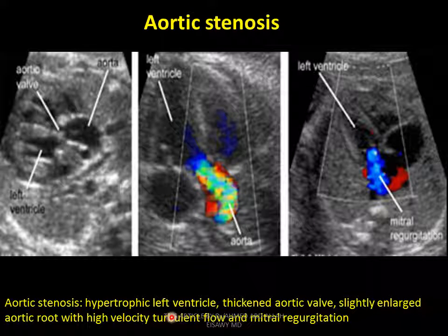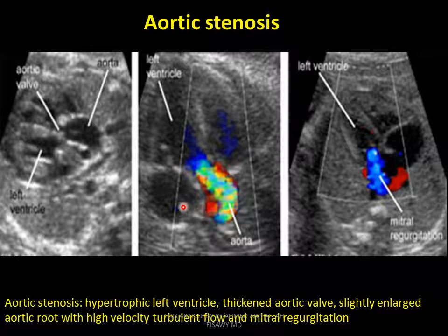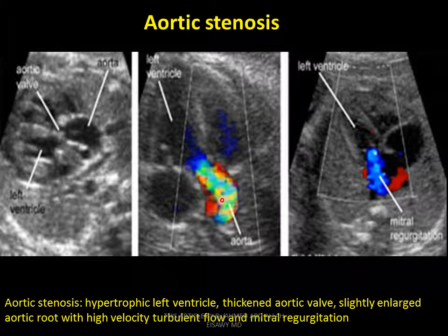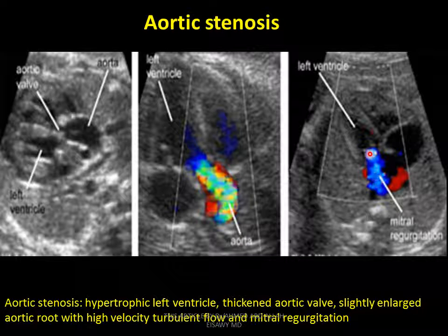We see either hypertrophic or dilated left ventricle in aortic stenosis. In hypertrophic left ventricle, the aortic valve is thickened. This is the left ventricle — hypertrophic with a thickened aortic valve. Slightly enlarged aortic root with high velocity turbulent flow and mitral regurgitation. As seen in the five-chamber view, slightly enlarged aortic root with high velocity turbulent flow, seen using color Doppler, and mitral regurgitation. The left ventricle and left atrium show regurgitation of the mitral valve.